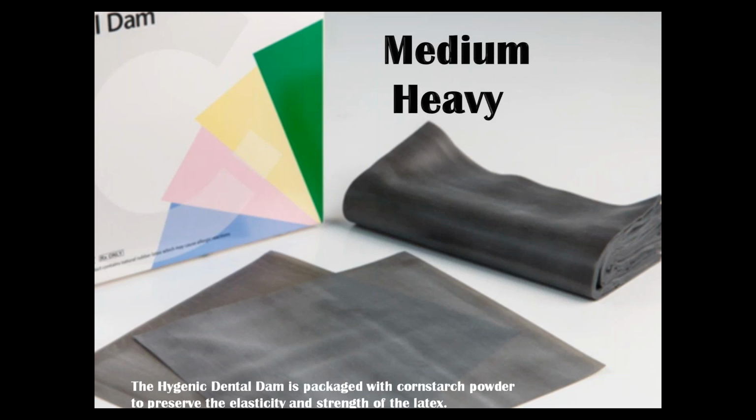Well, it is a very valid question, and probably I had the same question even when I was a postgraduate 20 years ago, no, 22 years ago. But yes, with experience, I can tell you that the most commonly used rubber dam sheet gauges are medium and heavy. Medium more or less covers most of your endo isolations, and heavy is excellent for restorative procedure isolations. And of course, you can use heavy even for your crown preps, which now is in demand because of the COVID-19 specifications.